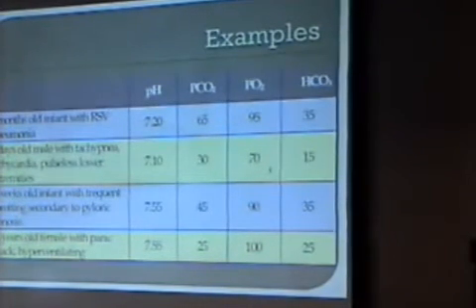Okay, 15-year-old female, with panic attack, hyperventilating. So alkalosis, alkalemia, respiratory or metabolic? Yes, no, maybe? Okay, so respiratory alkalosis, because usually this is an acute event that takes place.